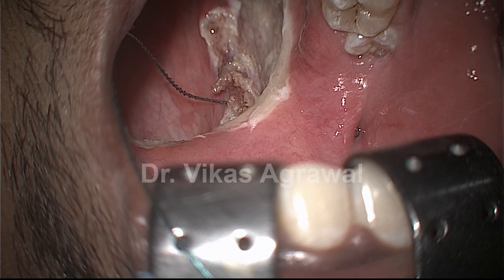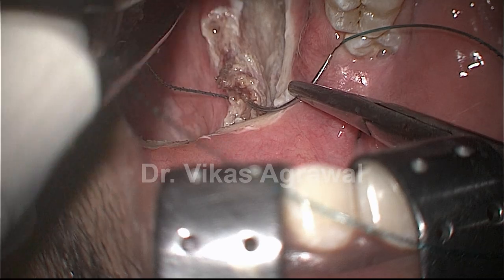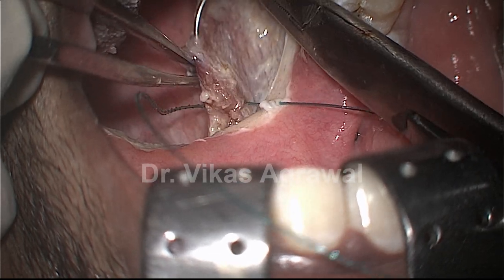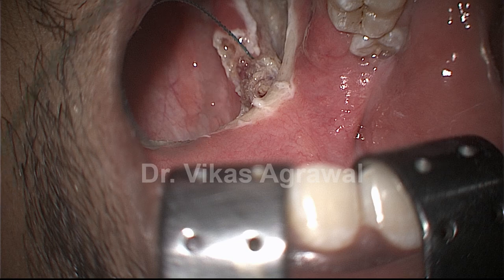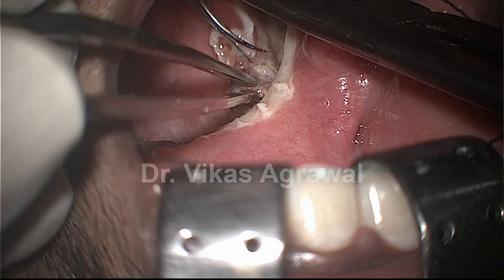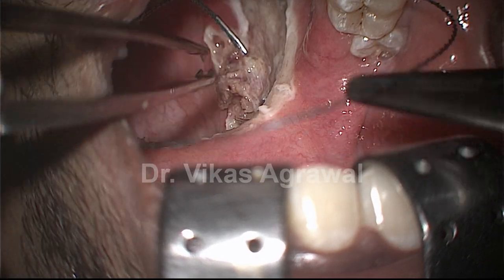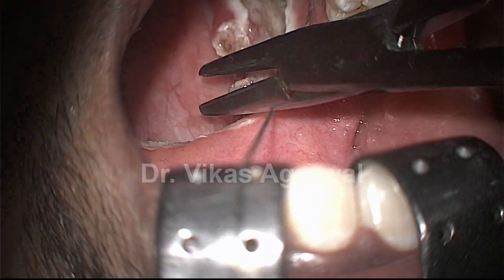We will take the whole bulk of the palatopharyngeus muscle, trying to expose the barbed suture minimally, and we will take the whole bulk of palatopharyngeus muscle as you can see here. Then coming back through the fibres at the upper pole. If required, we can also take sutures along the lateral pharyngeal wall, but in this case we know that it is not really required.